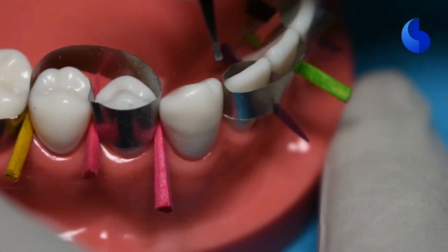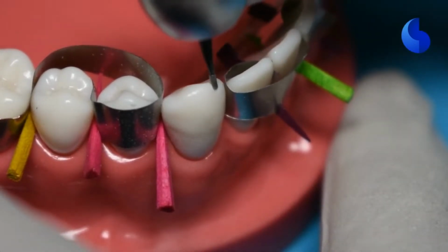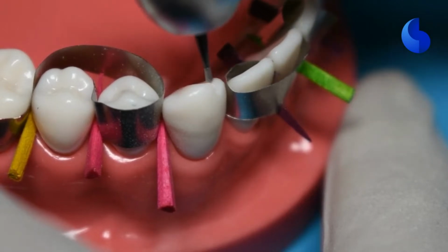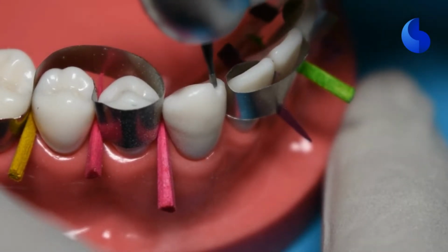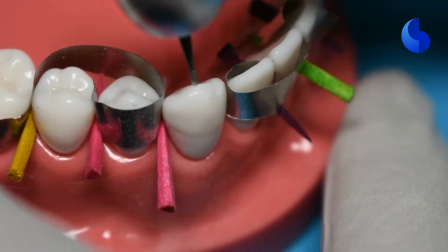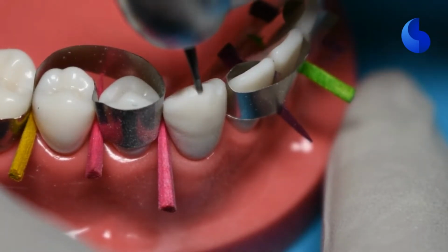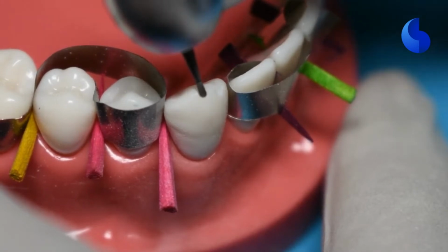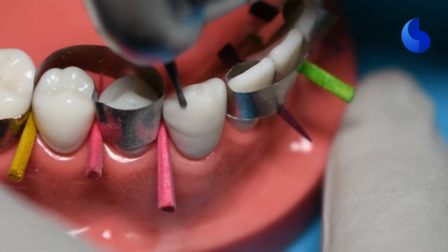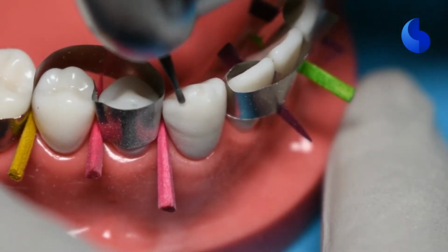So you can start off by placing 2 or 3 depth grooves in the incisal edge. Here we're using a 330 carbide burr to place those grooves. You can initially place it to about 1.3 millimeters. The reason is because you'll have additional loss of tooth structure when you're trying to remove those islands of tooth structure between the grooves and in the final finishing. So to give yourself some wiggle room, keep your depth grooves to about 1.3 millimeters.